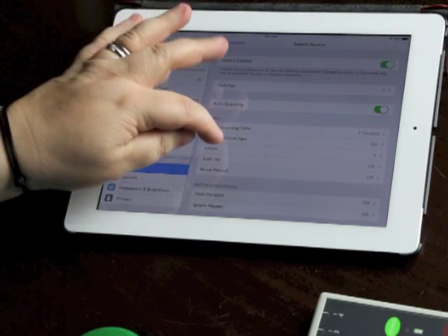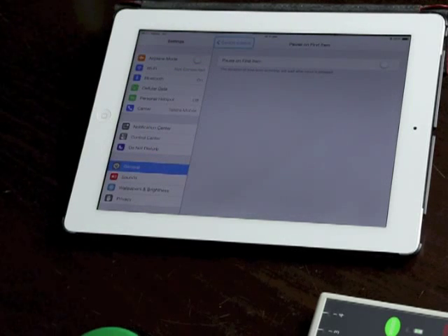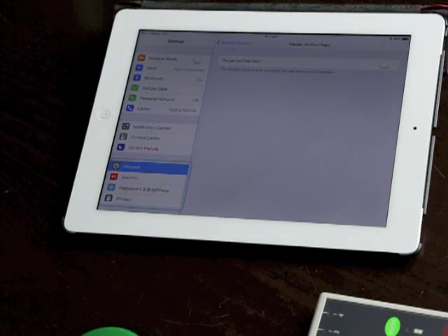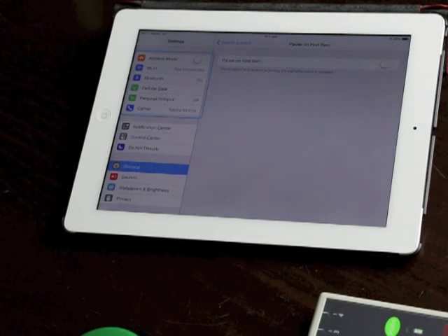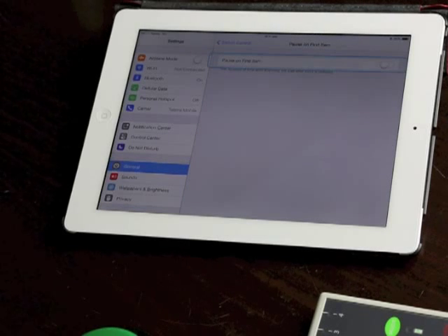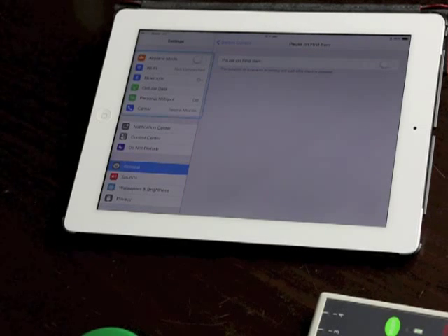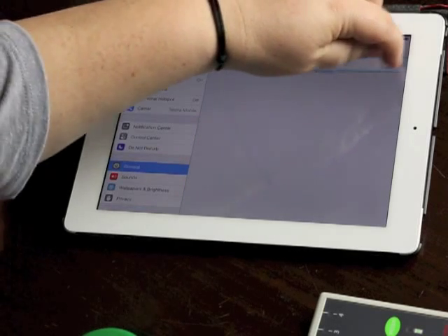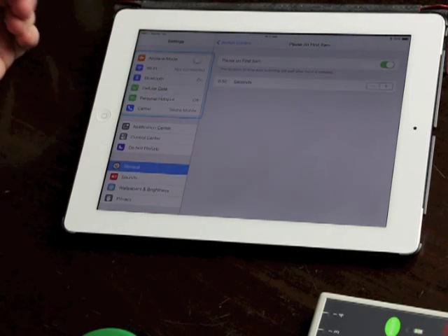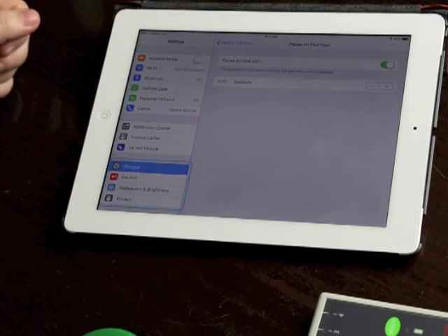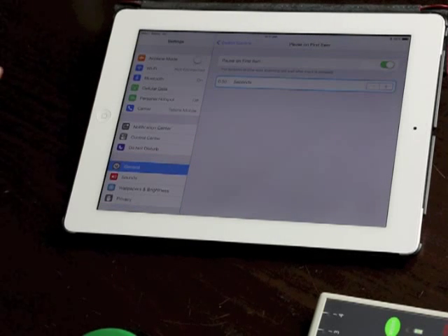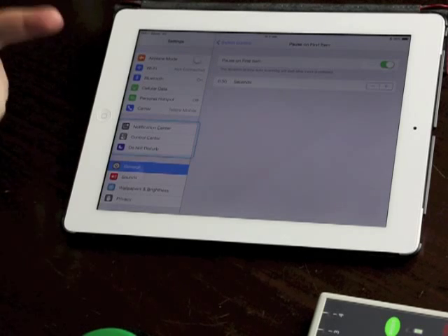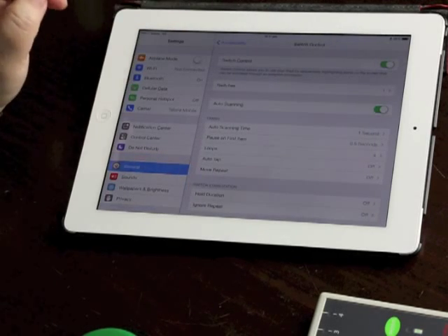Pause on first item is an interesting feature, it's something that's been available in traditional assistive technology. I know the Zygo McCaw used to have it and a lot of users that I worked with loved it, they loved having that extra time on the first item just to orient themselves and it made them much more accurate with their scanning. So I'm going to turn that on. The default is an extra half second so the first item will actually scan for one and a half seconds and then it'll move up to the one second timing.